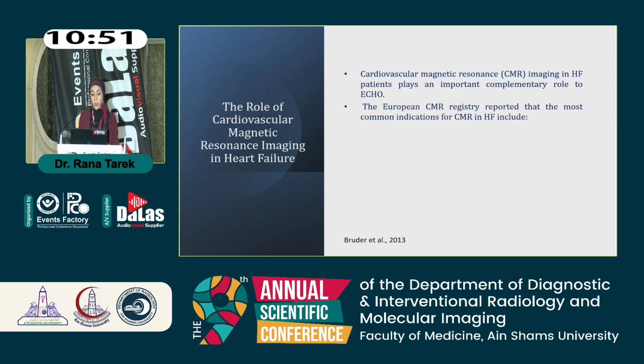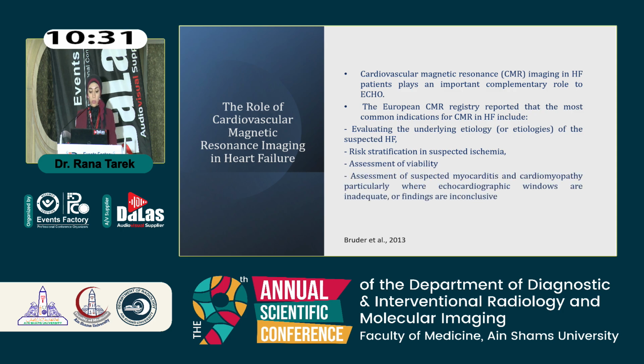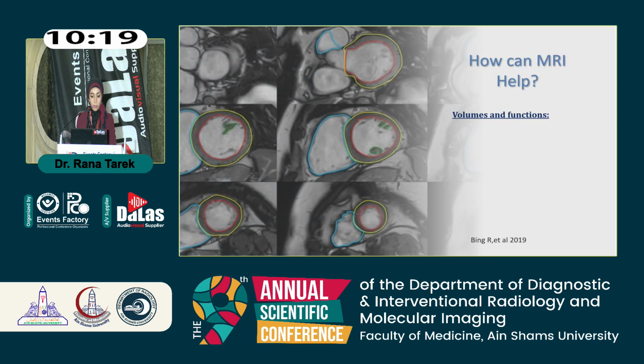According to the European CMR registry, the most common indications for CMR in heart failure include evaluating the underlying etiology or etiologies, which can be multifactorial, risk stratification in cases of suspected ischemia, assessment of viability, and assessment of suspected underlying myocarditis and cardiomyopathy, particularly when the echo window is not adequate or the findings are inconclusive. So how can MRI help?